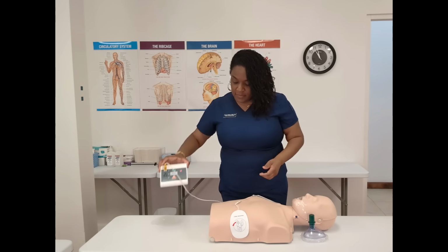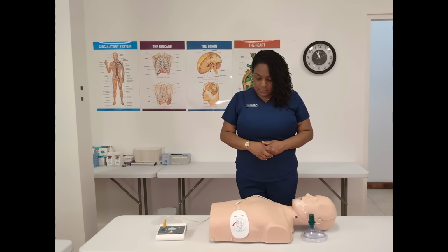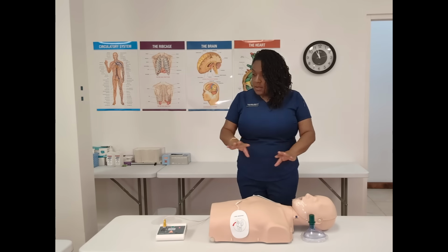Shock advised. Charging. It will flash when it's time for me to press the button. Stay clear of patient. No one touch. Everybody remain clear. Deliver shock now. Press the orange button now. The button that's flashing is what I'm going to press. Shock delivered. And we go right back into our chest compressions. Begin CPR.